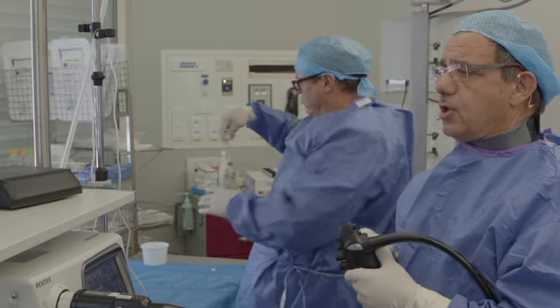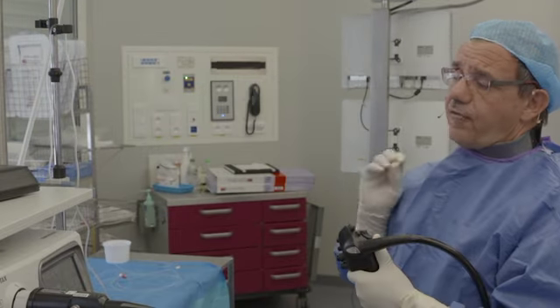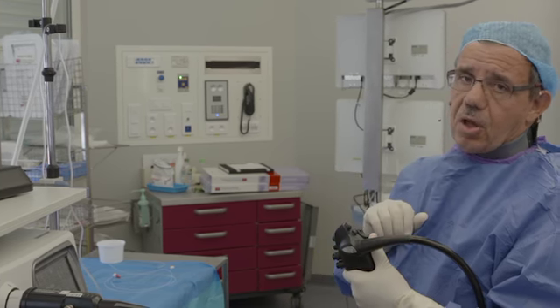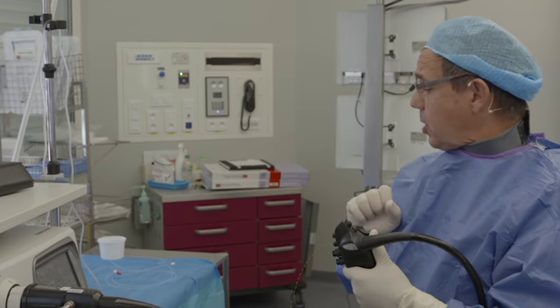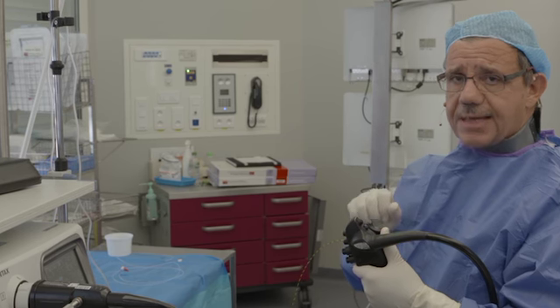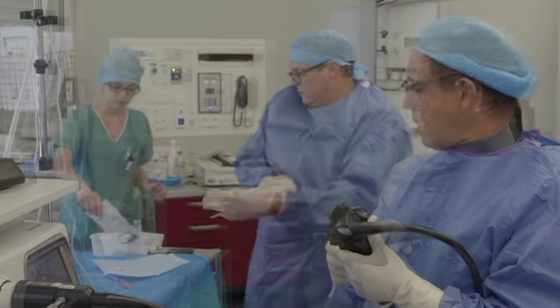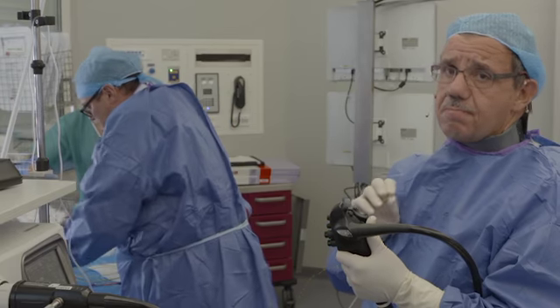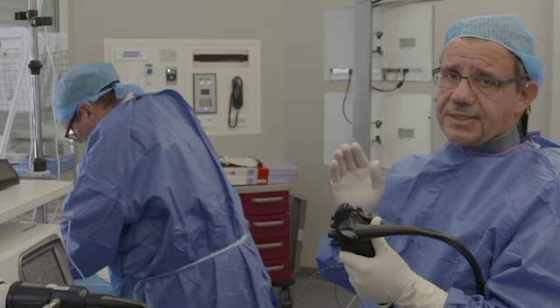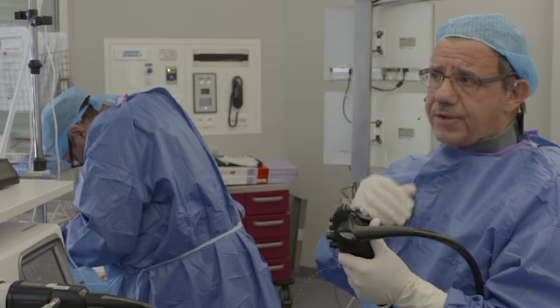And I will use first the brush cytology, the Cook brush. The technique of brush is to apply back and forth movement of the brush at the level of the stenosis, and after, in our institute, we cut the brush and we leave the brush inside the cytolith. And the cytolith is the same liquid that we use for the EUS-FNA. Regarding the biopsy, the minimum number of biopsy is 3. And the accuracy of the biopsy increases with the number of biopsy. The best accuracy is for more than 3 biopsy.